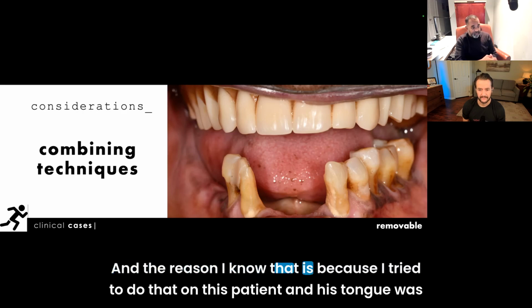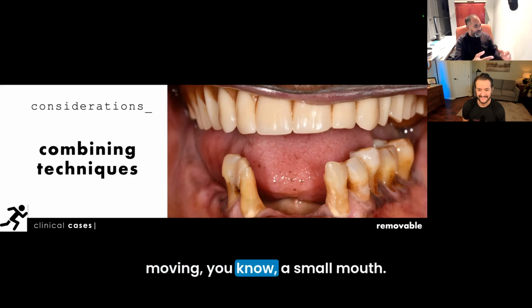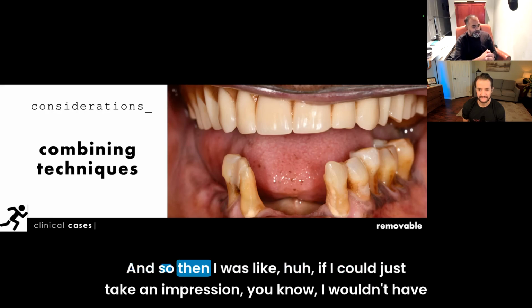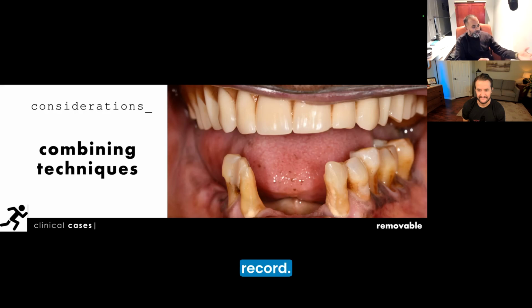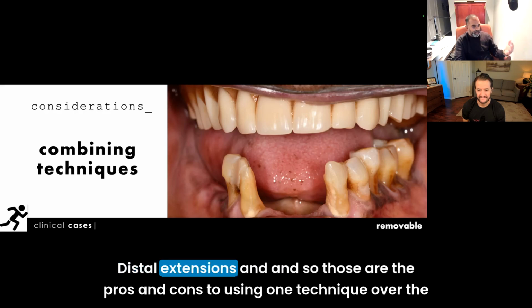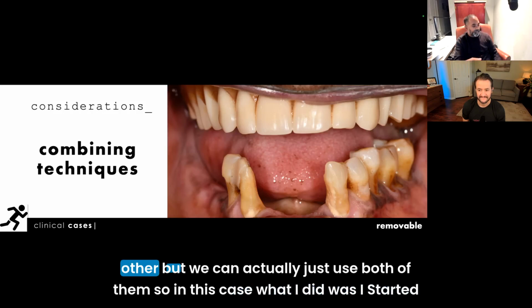And the reason I know that is because I tried to do that on this patient, and his tongue was moving, a small mouth, and so then I was like, if I could just take an impression, I wouldn't have to worry about that. We could just put some periphery wax, I could get an alginate, and I could really record the distal extensions. And so those are the pros and cons to using one technique over the other, but we can actually just use both of them.